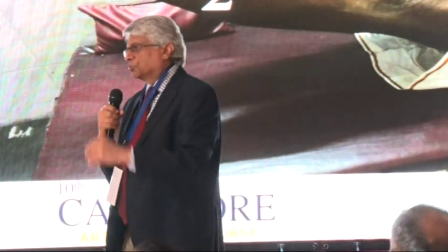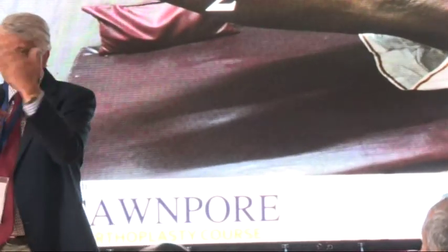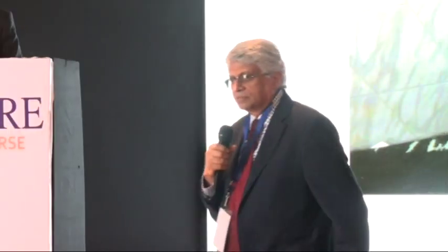If you get osteoporosis in a patient, you need to correct your biology, which is all this, and correct the mechanics. I think this was osteoarthritis knee, and it developed osteoporosis, and it is totally a mechanical failure. It looks like a mechanical failure, and on X-ray you cannot say what the ligament balancing was, what exactly the implant was. Only on AP view, you cannot know the biomechanics of the total implant and all these things. So it was totally a mechanical failure. I think it's not the osteoporotic failure.